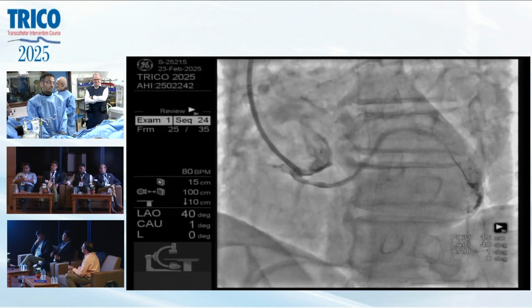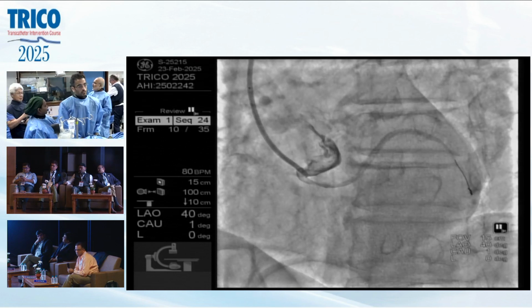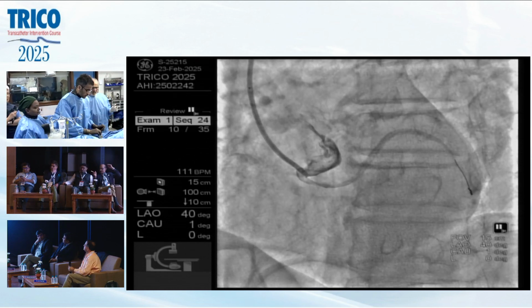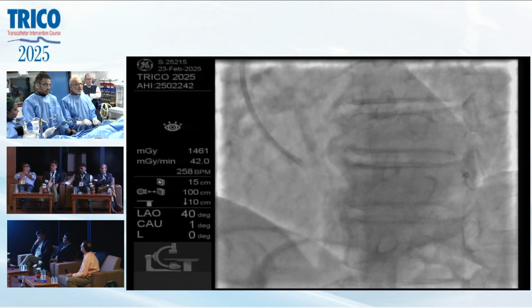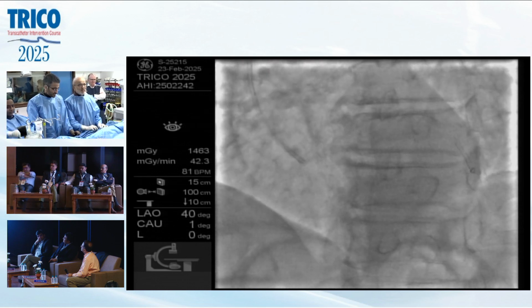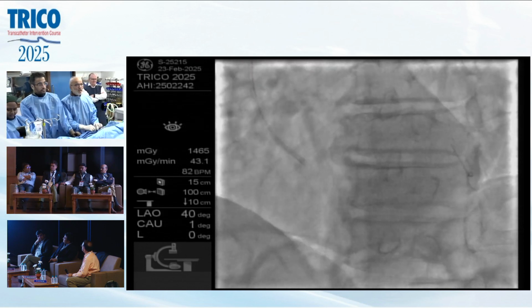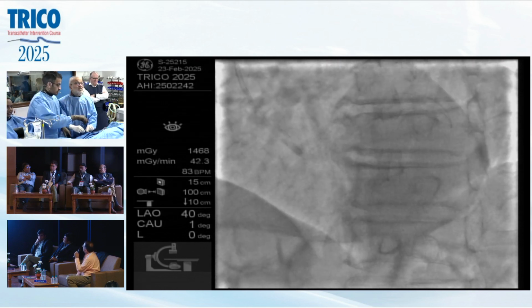Get me a non-compliant balloon, that 3 millimeter balloon, NC balloon. This is again Indian made. This time, we have seen good Indian products working so well, in 2 Myval cases, and the wire as well, which is good.